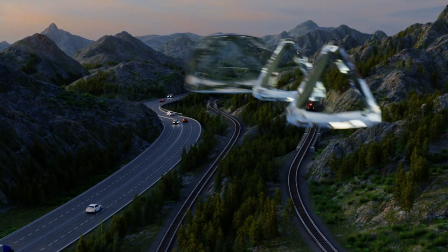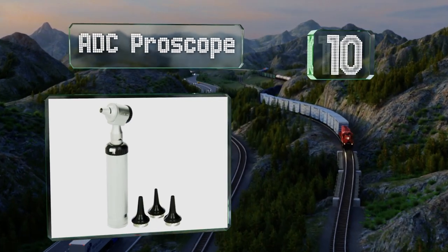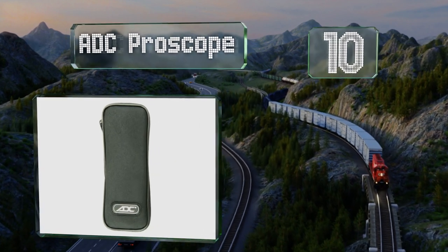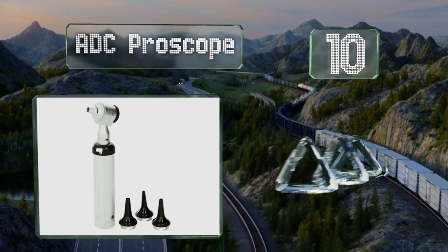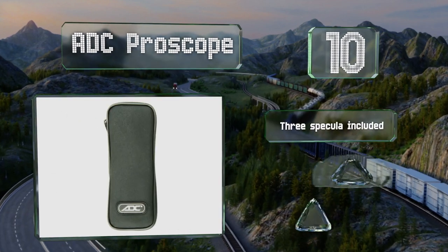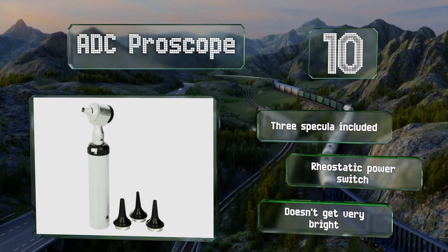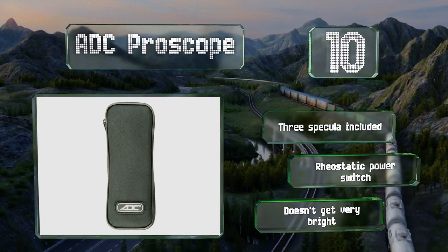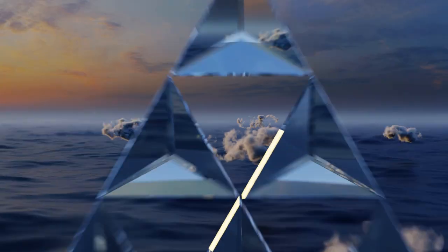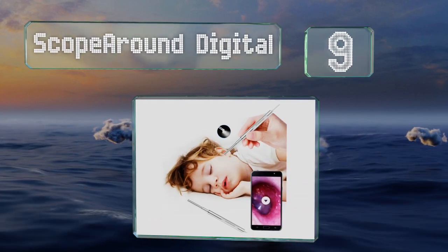Starting off our list at number 10, weighing less than one pound, the ADC Pro Scope is a compact and lightweight design with a bayonet locking head, satin finished handle, and knurled texture that makes it easy to grip. The two required C-cell batteries are not included, though it comes with three specula and a rheostatic power switch. However, it doesn't get very bright.